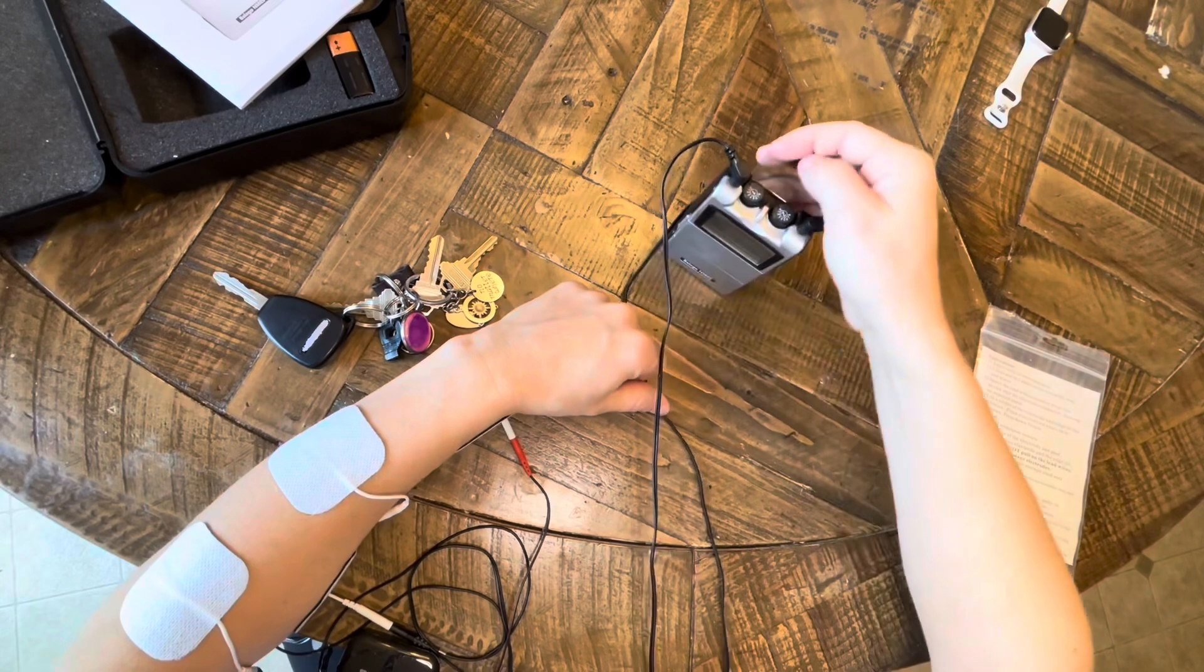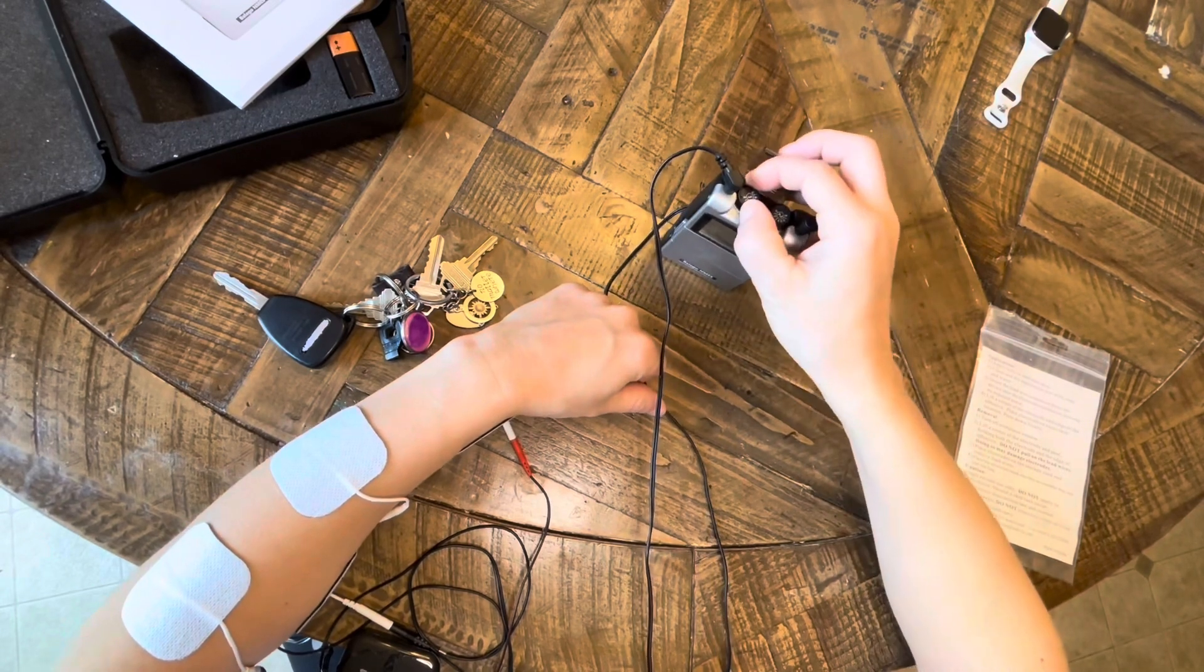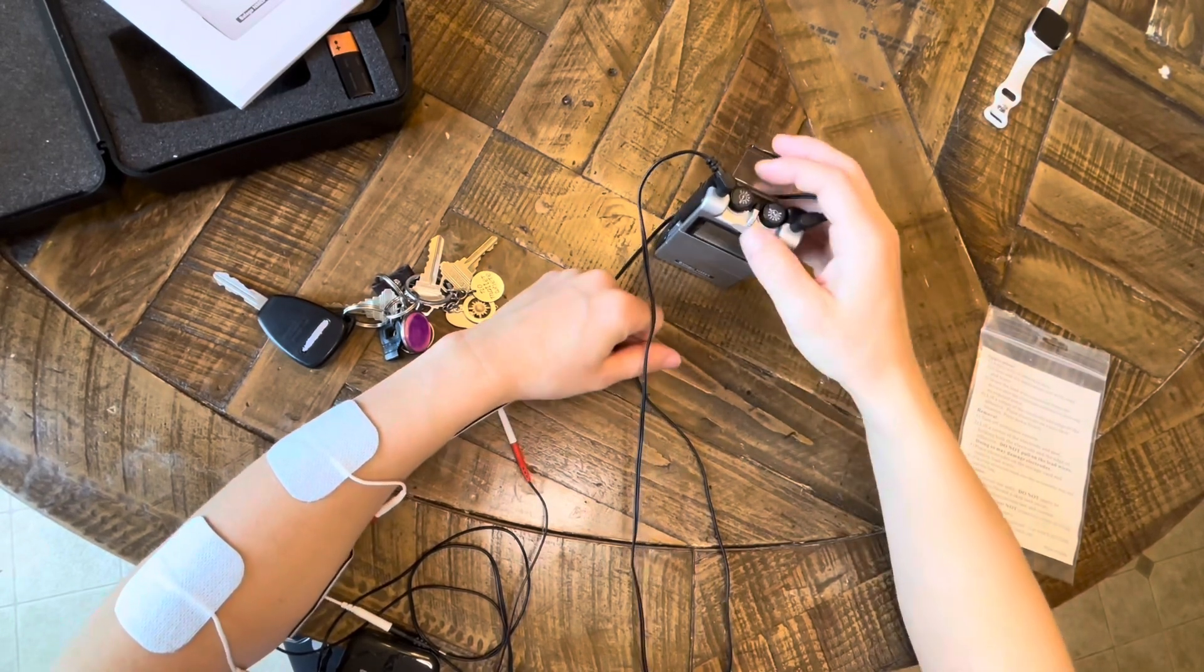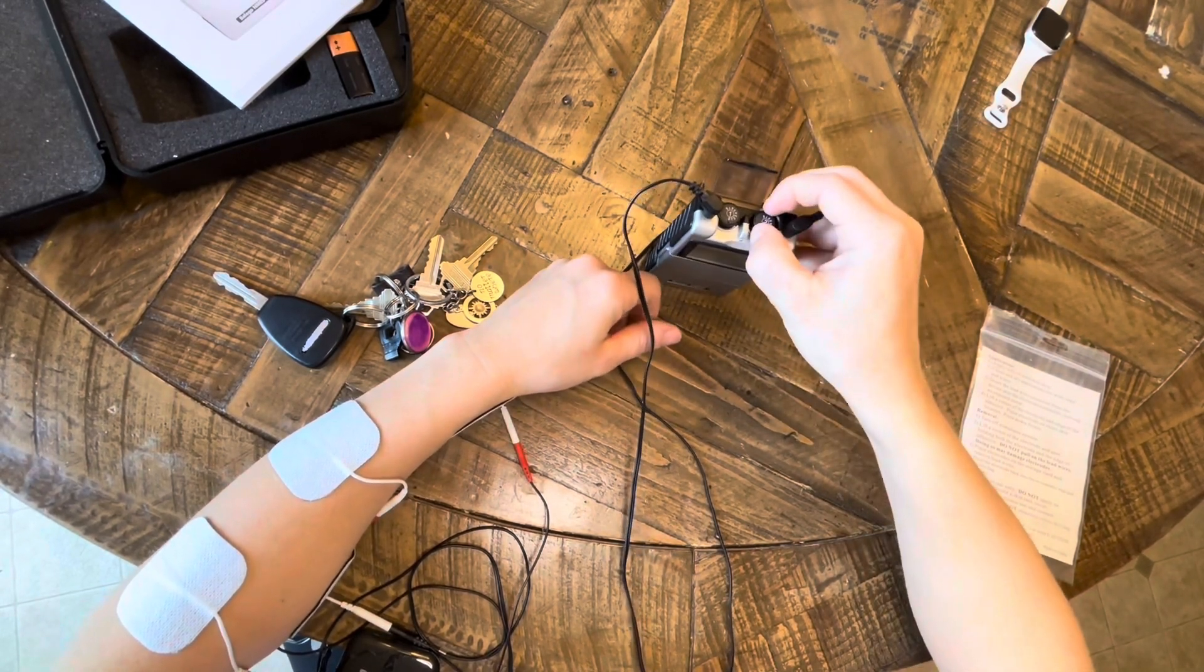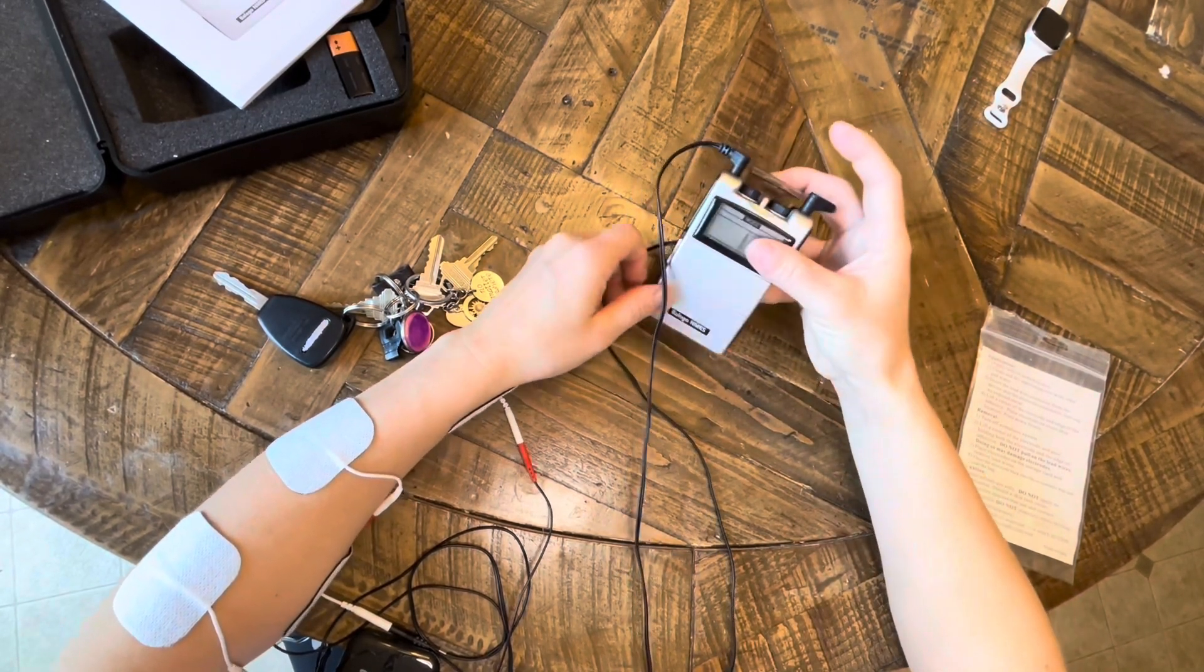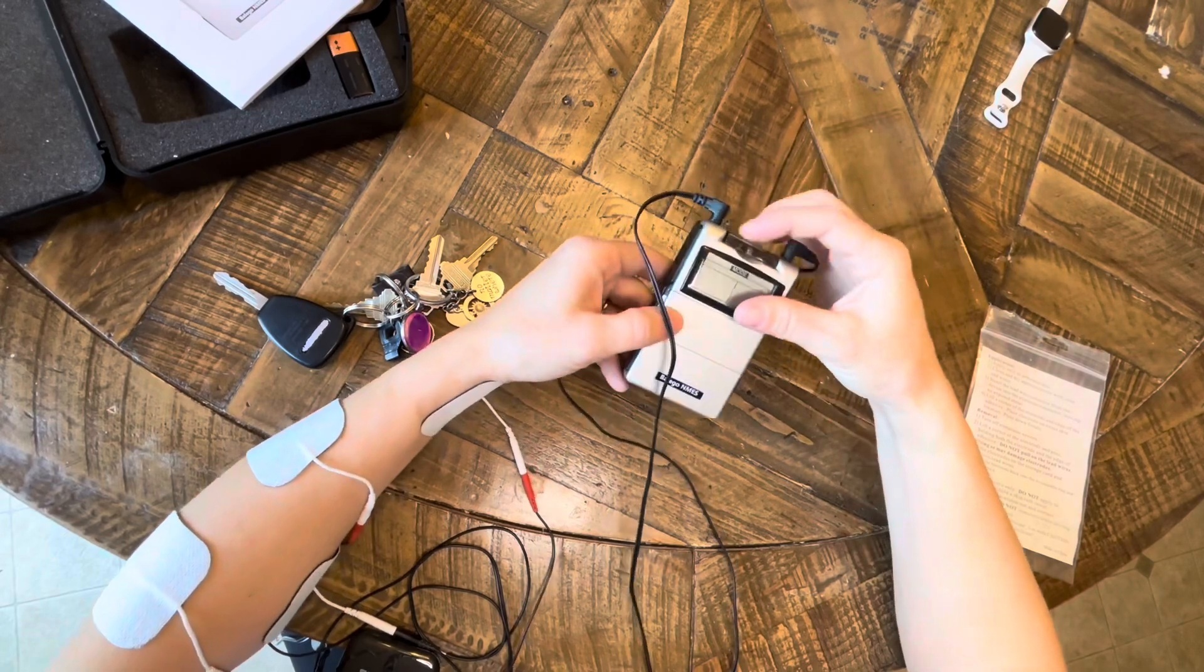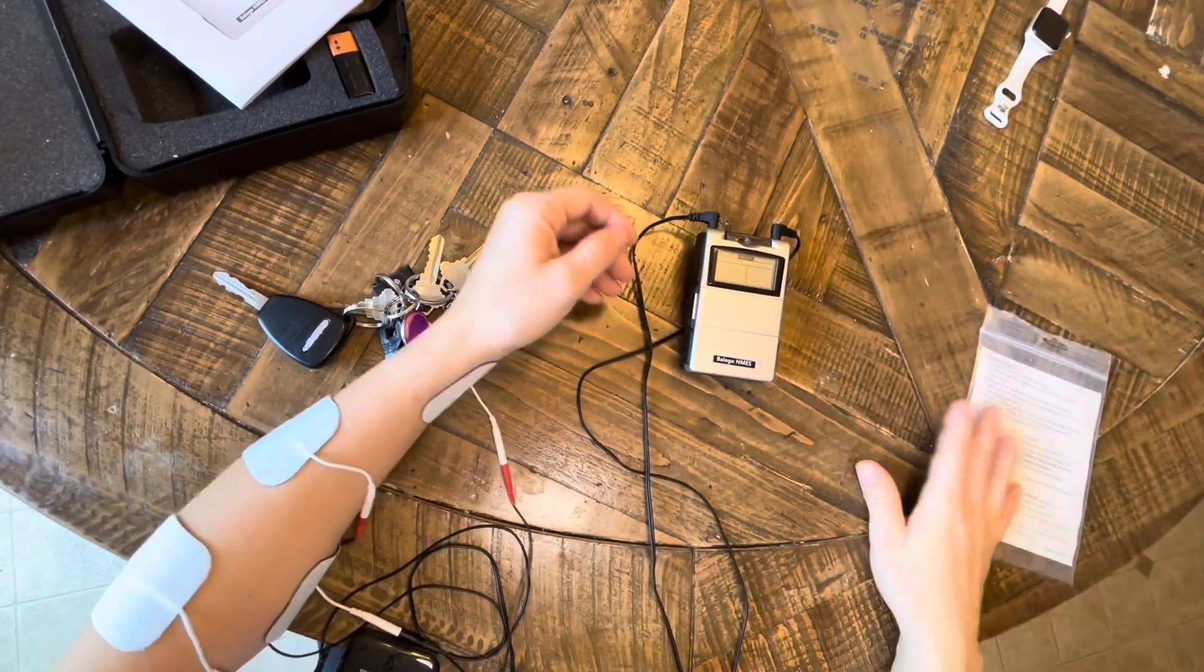All right, and then when you run out of time or you're done, you'll just turn the dials to turn it back off, and then you'll disconnect everything.